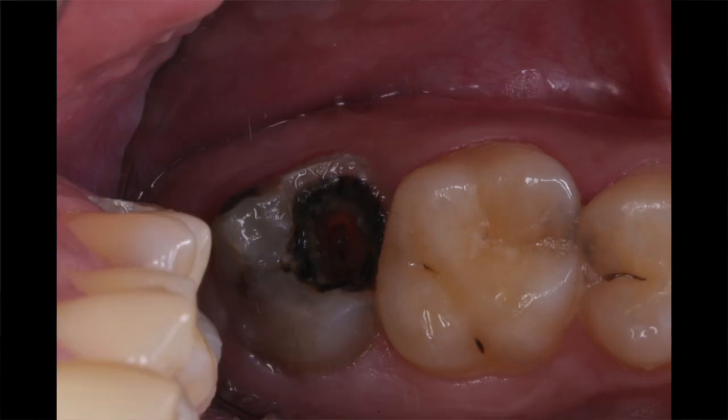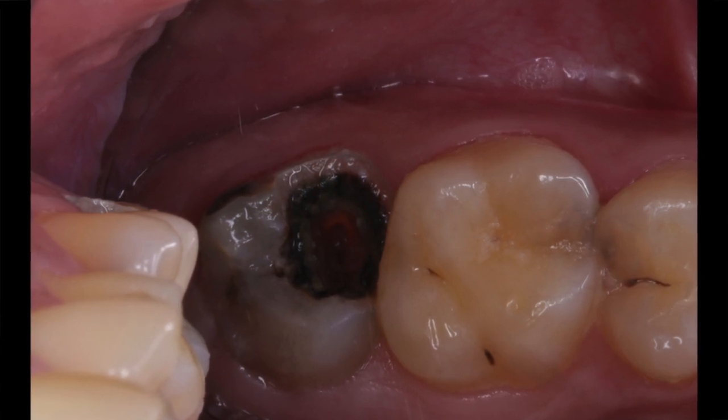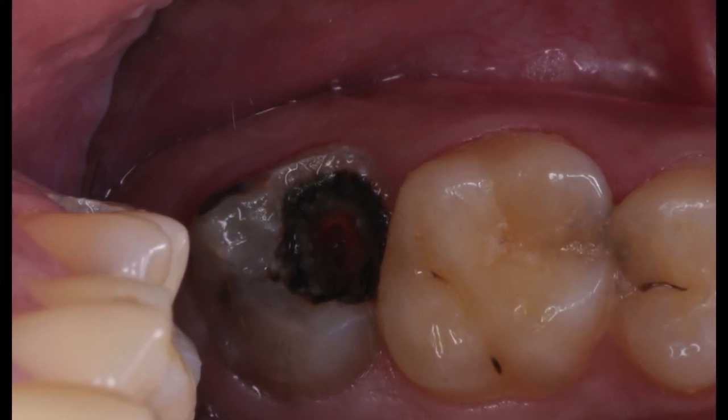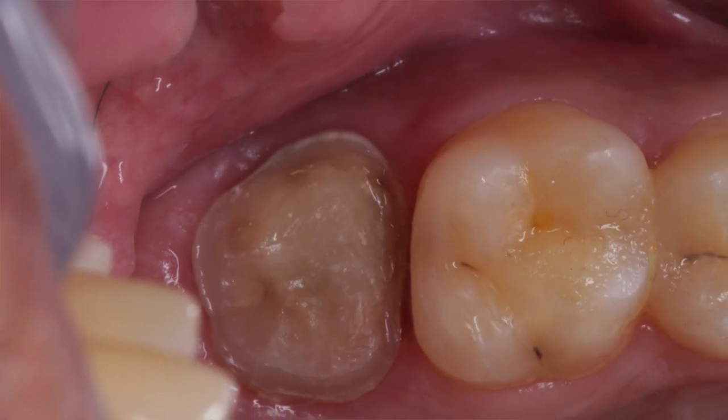I'm Dr. Samir Thukral. Have you ever wondered how your dental crowns are made? Let me show you. So this is a tooth that has a large cavity in it. This tooth needed a root canal, and after the root canal was completed, we went ahead and prepped the tooth to receive a crown.